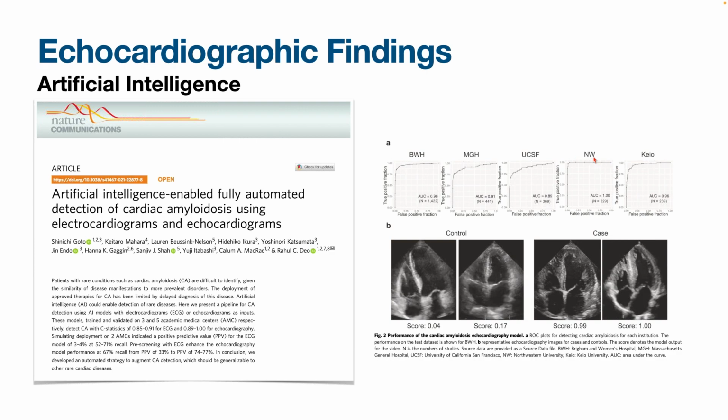They trained the model, and then applied it to another set that was done in echo with a thickened wall, and they are able to substantially increase the positive predictive value of identifying patients, from 33% to about 74 to 77%, by using this two-step method. So again, using very simple key features, they can screen patients with a reasonably good outcome.